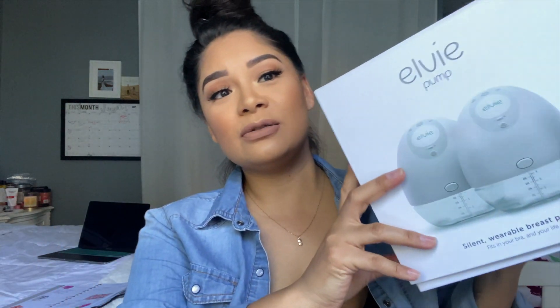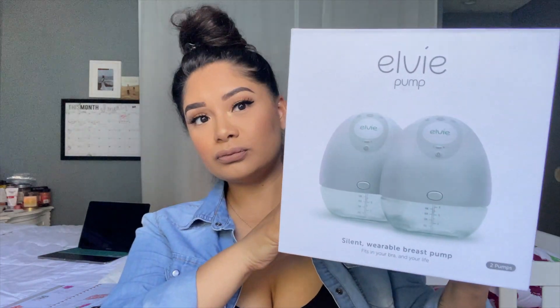I typically pump for anywhere from 30 to 45 minutes, sometimes even an hour or more, depending on what I'm doing. This is what the box looks like. With the Elvie pump, I have the double pump — you can buy just one if you want, which is great for women who've had a mastectomy and only have one breast available for pumping. I think that's great because it includes every woman.